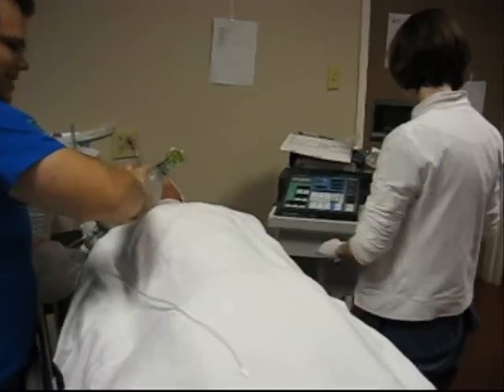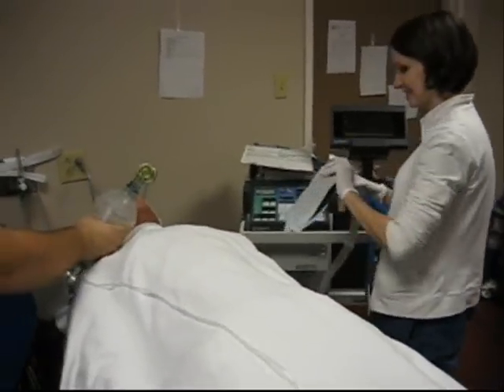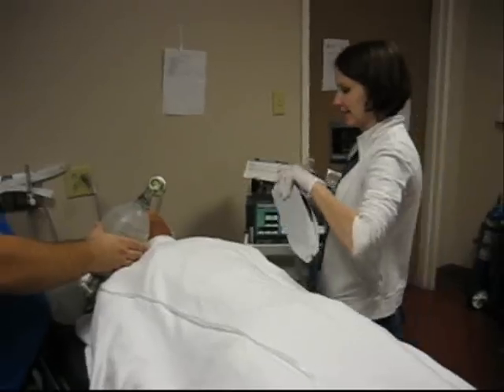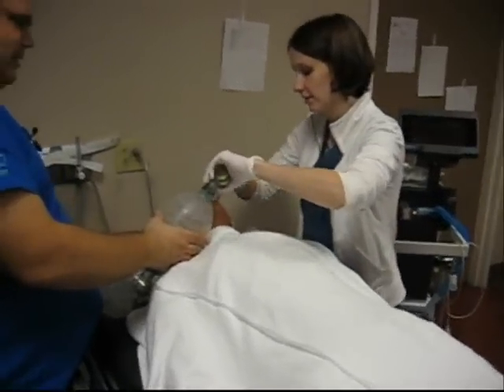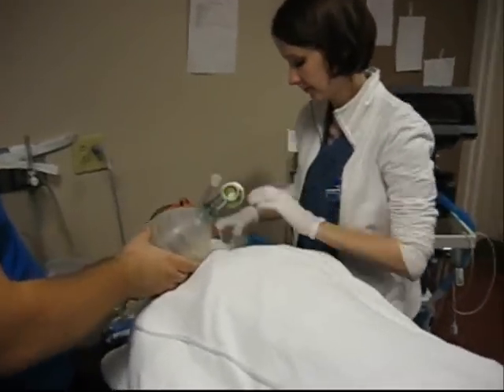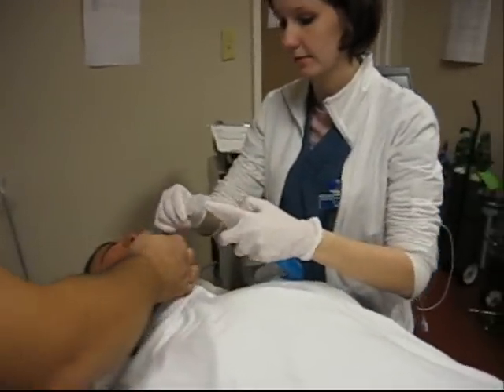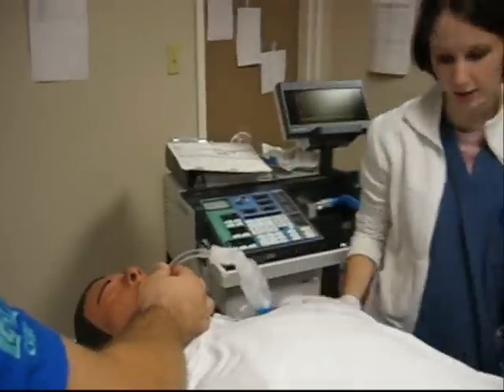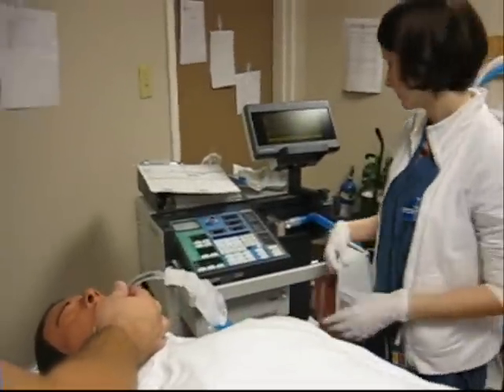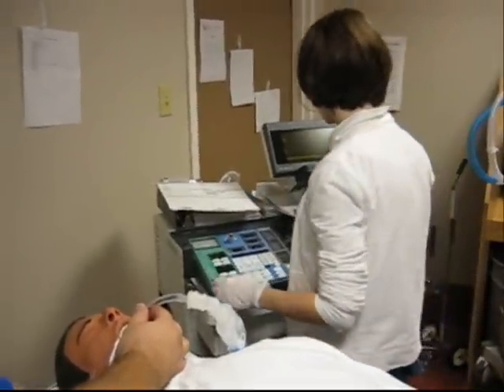Discontinue the manual ventilation when appropriate to do so. This may be when ventilation is no longer required, or when the initiation of mechanical ventilation, having placed an artificial airway, is undertaken.